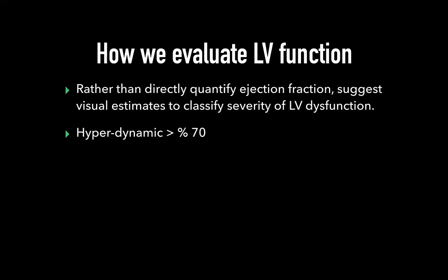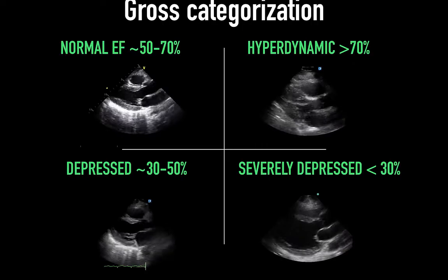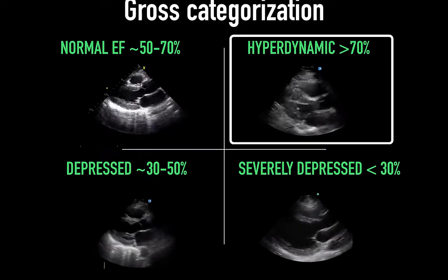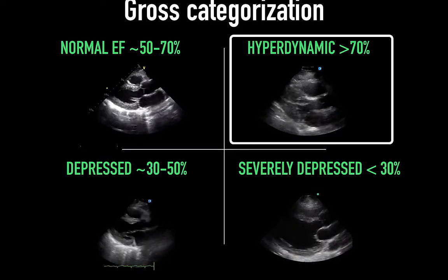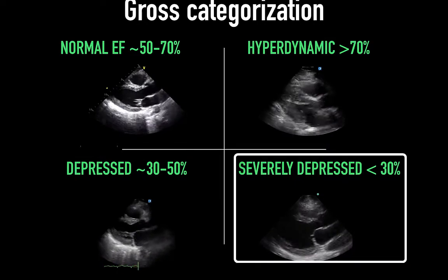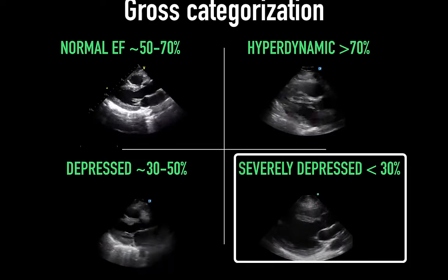On to gross categorization. We will parcel LV function into relatively discrete categories: hyperdynamic, greater than 70%; normal, 50% to 70%; depressed, 30% to 50%; and severely depressed, less than 30%. Here's a sense of the gross categorization between normal, hyperdynamic with very low end-systolic cavity volume, depressed with reduced amounts of wall motion, and severely depressed to almost akinetic amounts of wall motion.